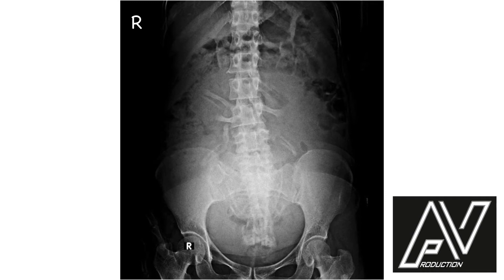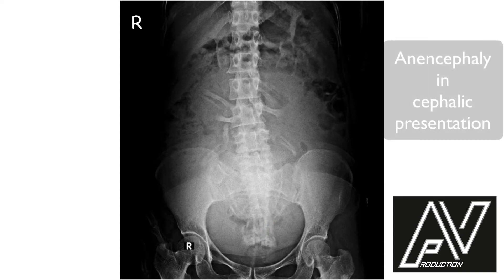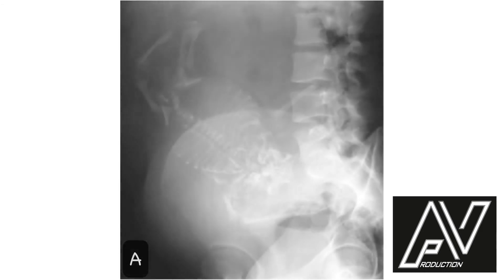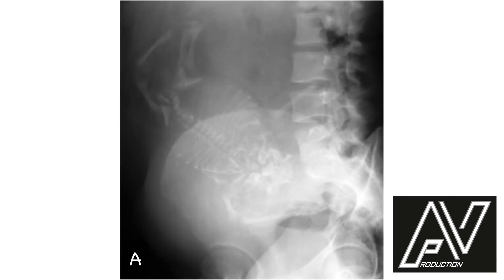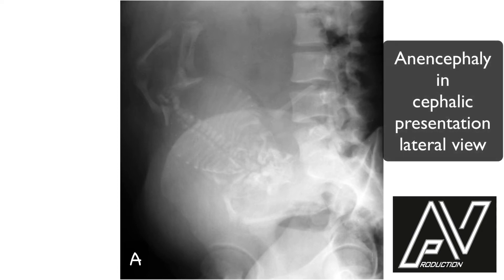This is a plain x-ray of the abdomen and pelvis, AP view, well centralized, well exposed, showing a single fetus in longitudinal lie, flexed attitude. The presentation is cephalic. However, the skull vault is absent and only the base of the skull can be seen. Therefore, by inference, the presenting part is face and my diagnosis is anencephaly in cephalic presentation. This is the lateral plate of the same patient showing a single fetus in longitudinal lie with cephalic presentation and no skull vault. Therefore, the diagnosis is anencephaly in lateral view.